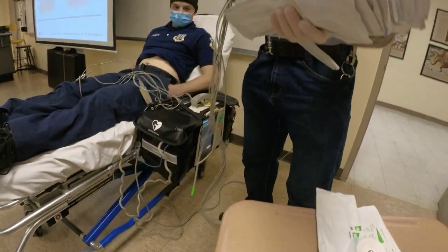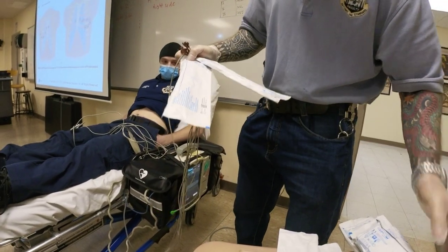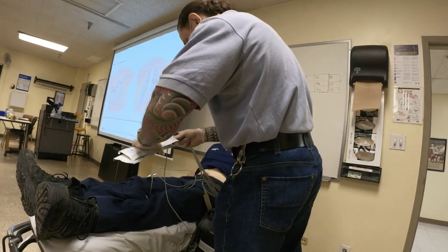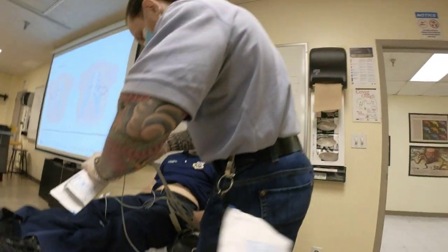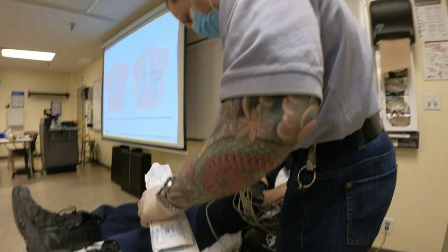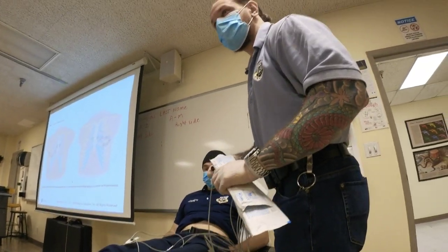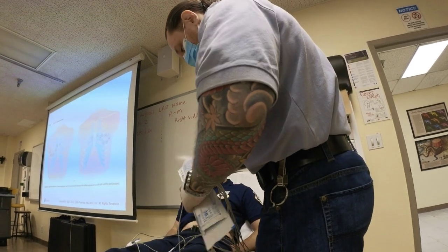Yeah. So what's the problem with that? Do they expire? The manufacturer gets more money. But how does this impact me? You got to pay for it. Excellent, right? So what about the conductive gel? It's not going to grab the skin. Excellent.